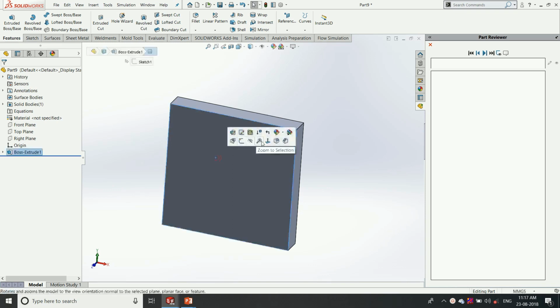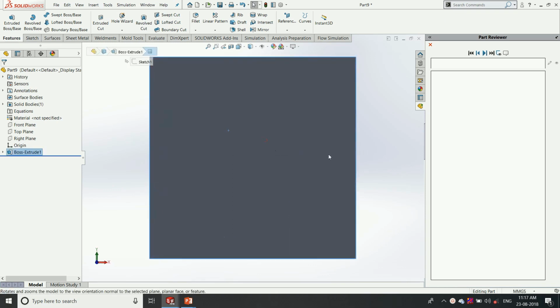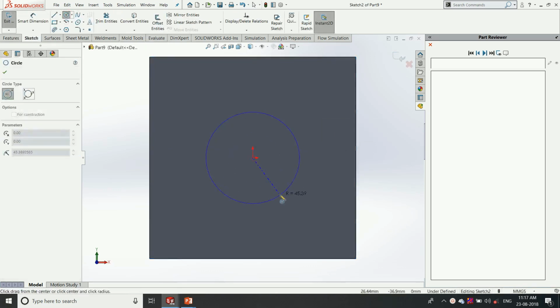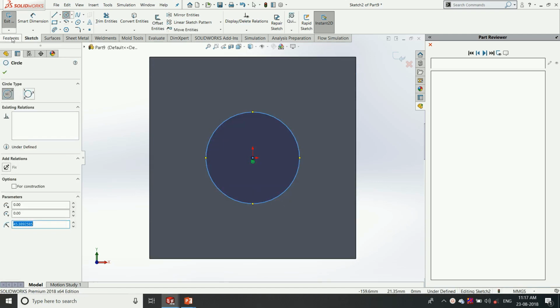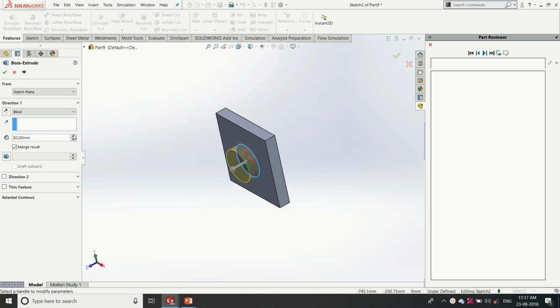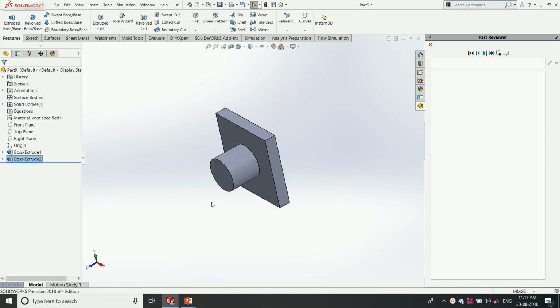Then by choosing the face on which you need to draw another sketch, you can choose the face. Then any particular dimension you need, you can choose it. Then you can go for the three-dimensional specifications. So like this, we can easily design 3D models.